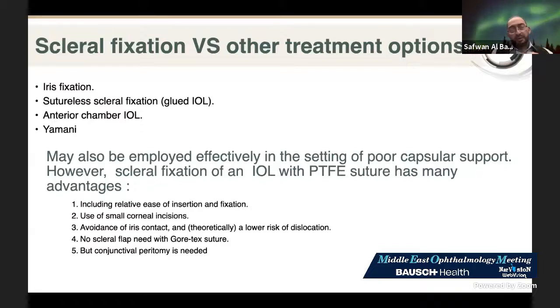Even in Yamani and glued, we use a small incision. Also avoidance of iris contact and, theoretically, a lower risk of dislocation and pigment dispersion glaucoma. No scleral flap is needed with the Gore-Tex suture, but a conjunctival peritomy is needed, in contrast to Yamani, where we don't need any conjunctival peritomy.